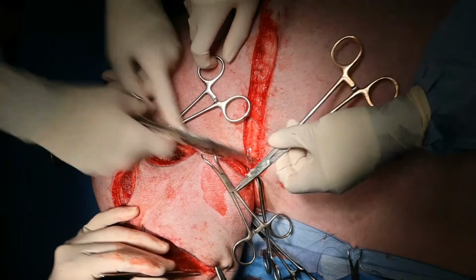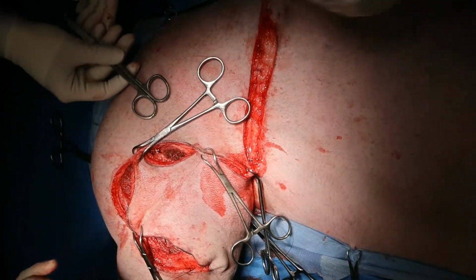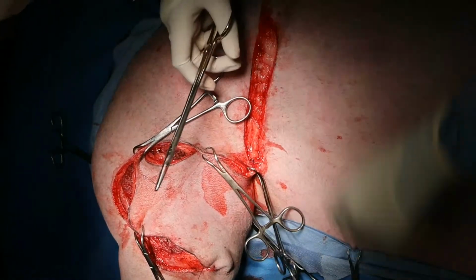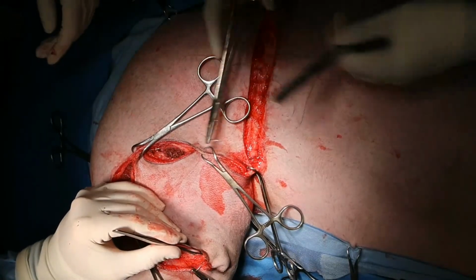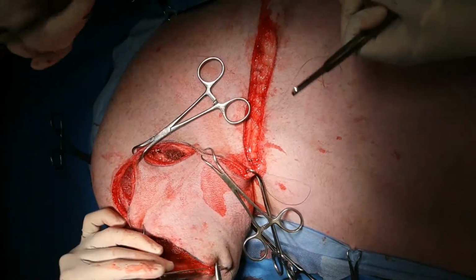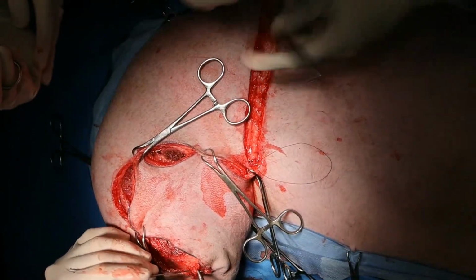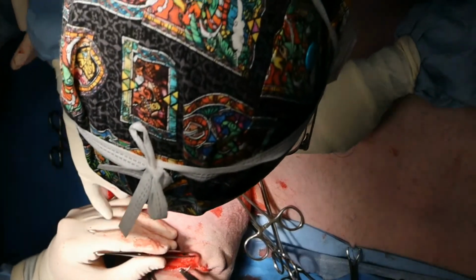Do you want me to put it down rather? It's okay. Here you can use... Thank you. Are they just nails? Yeah. I'll try to keep them on. And I'm not going to tack down the middle of the flap because I don't want to compromise any of the blood vessels within the flap.